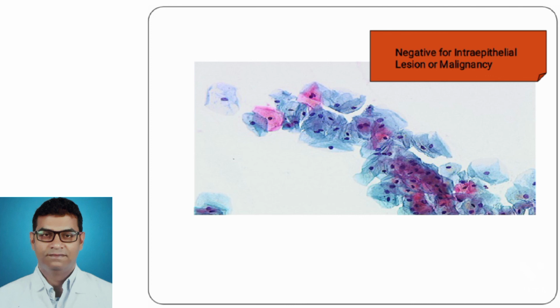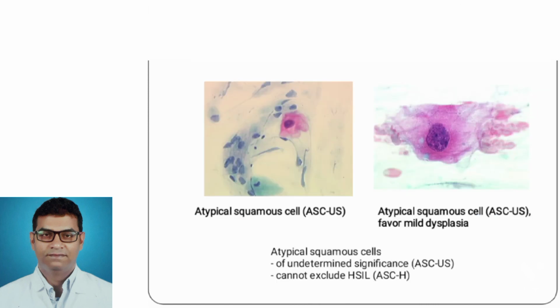This is a beautiful picture showing the cervical Pap smear, negative for intraepithelial lesion or malignancy. Atypical squamous cells of undetermined significance with mild dysplasia.